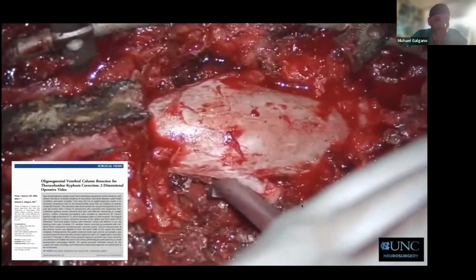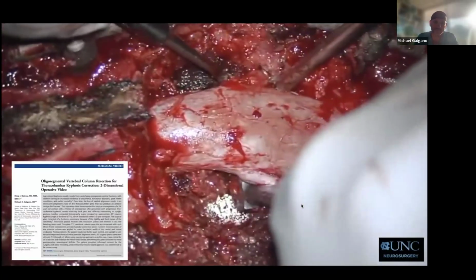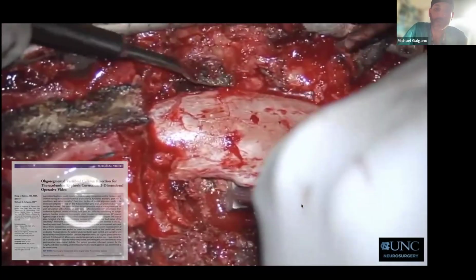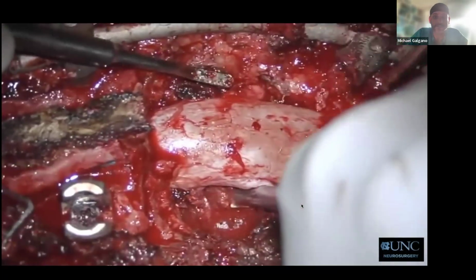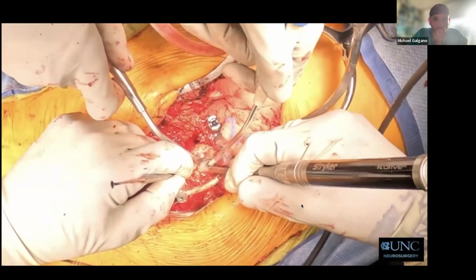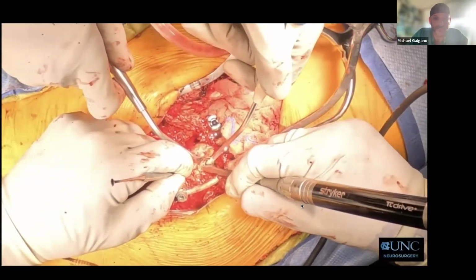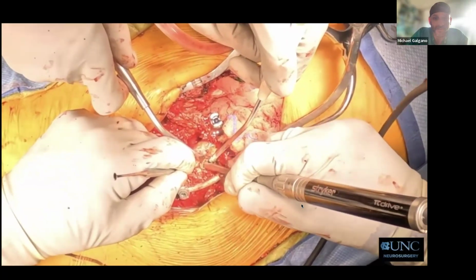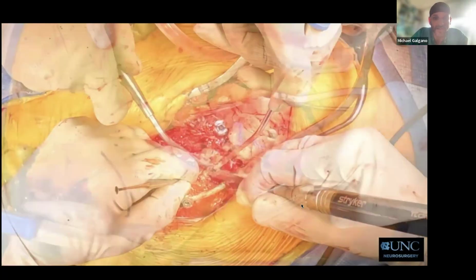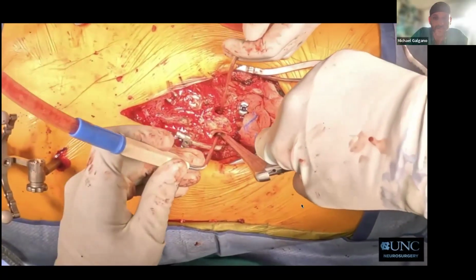And it's super important for the surgeons out there that you really dissect the posterior longitudinal ligament from the anterior dura. Once you establish that plane, which is actually very tricky to do in these infection cases, then you can start passing your Woodson elevator and your tools, such as the PSL impactor, in the anterior epidural space, and then start impacting that into your corpectomy cavity.